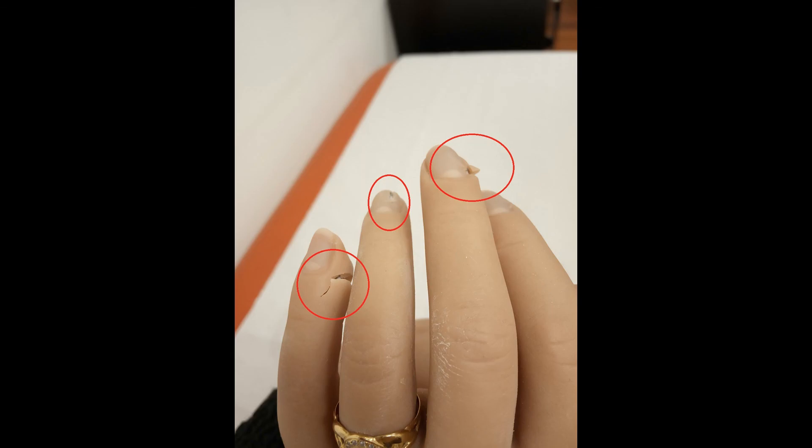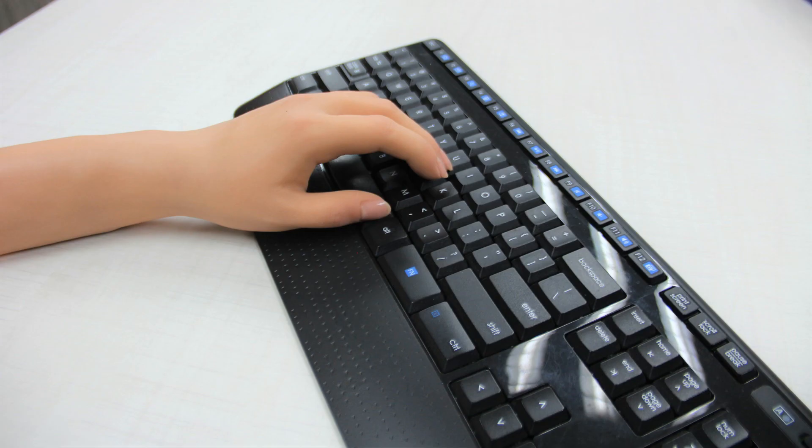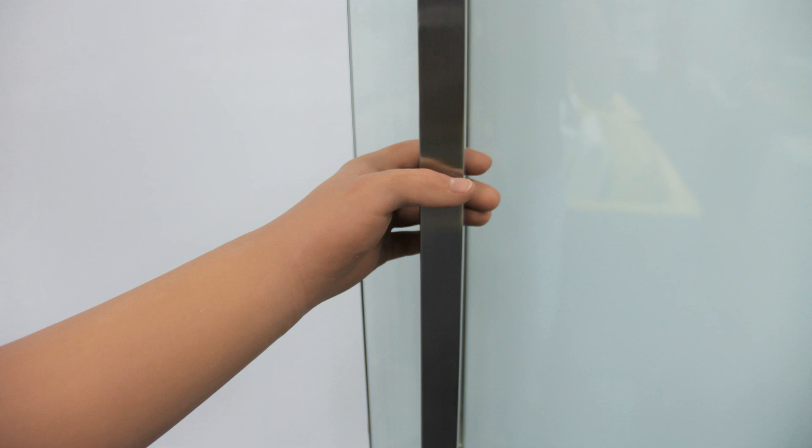Here are some examples that will increase the chance of damage: using the prosthesis to carry bags, using the prosthesis to type on a keyboard, using the prosthesis to drive a car, and opening a door or pulling a handle.